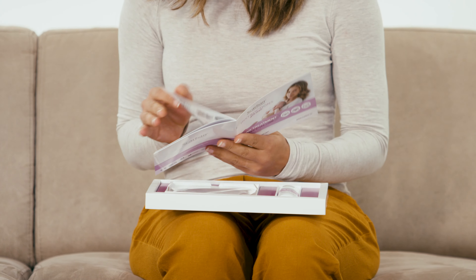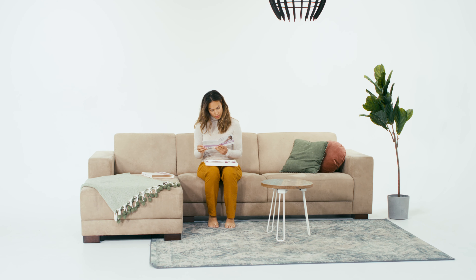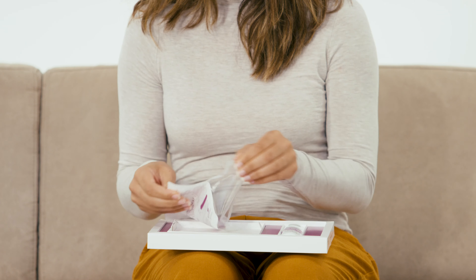You can start using Scar Band immediately when the wound has closed, if there is no scab formation and if any stitches have been removed. Existing scars can be treated immediately with Scar Band.